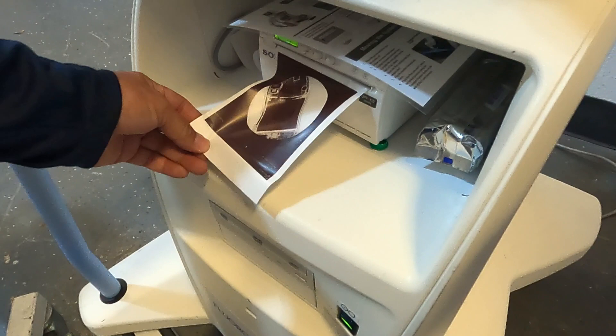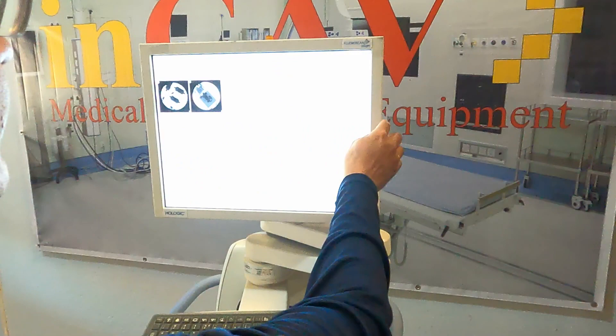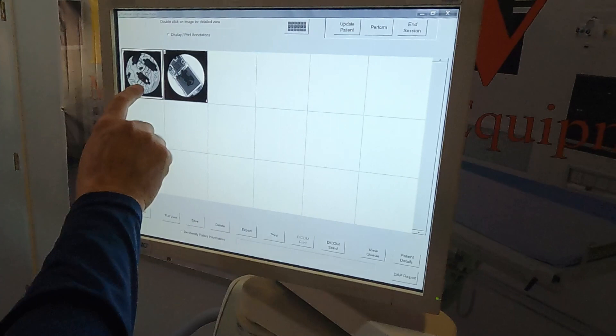Here you can see the image. On the register screen, we can see all the patient images. We can load any image by clicking on full view and enter into editing mode.